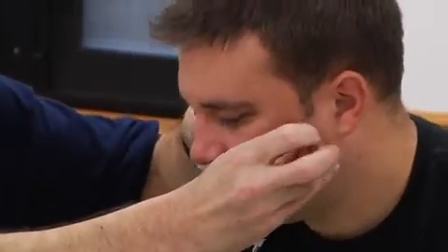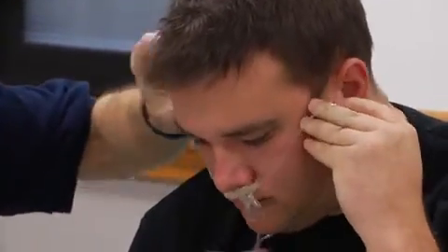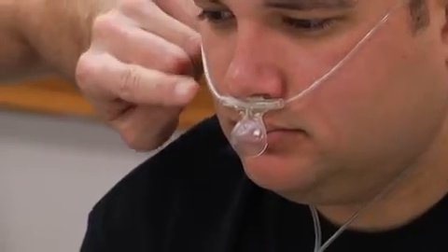I have an end-tidal cannula here that can both monitor and administer oxygen. We'll put this on the patient like a nasal cannula and apply the CPAP mask over it. This cannula has a nasal pillow that measures what comes out of the mouth for end-tidal monitoring. If you're measuring end-tidal using CPAP, you must have that pillow over the mouth, or the gas flow will dilute the carbon dioxide reading. There will be a small leak on each side where the cannula exits from under the mask — don't over-tighten, as that causes leaks in other areas. That small leak is still adequate to maintain the needed pressure.